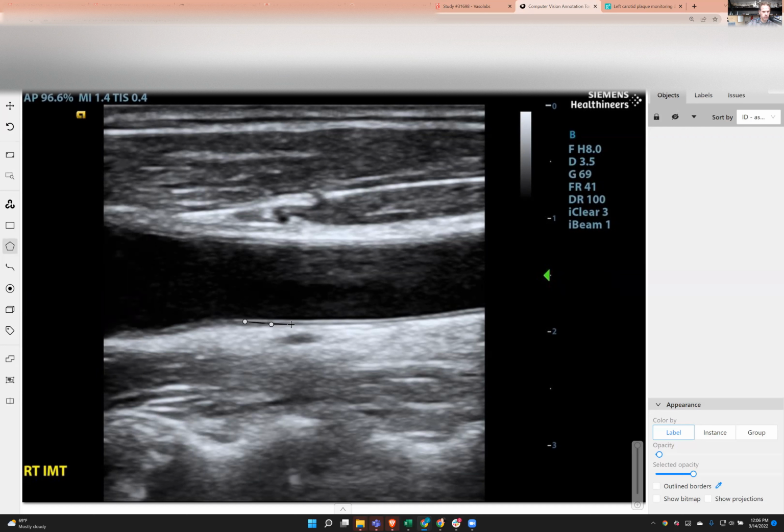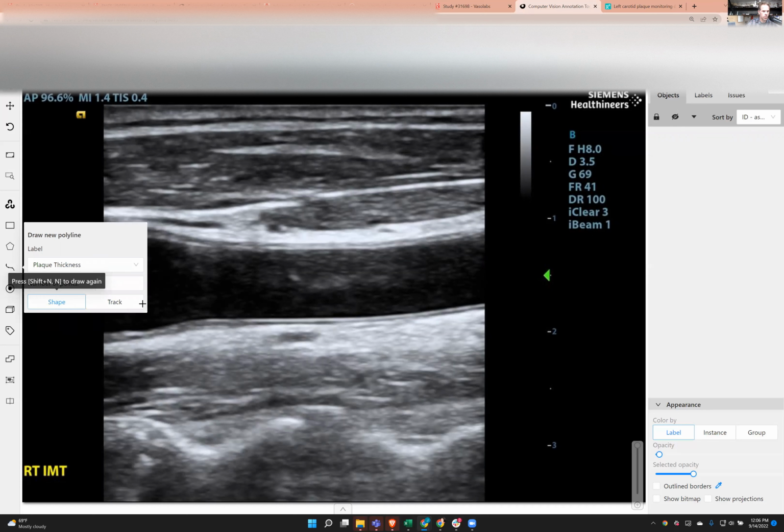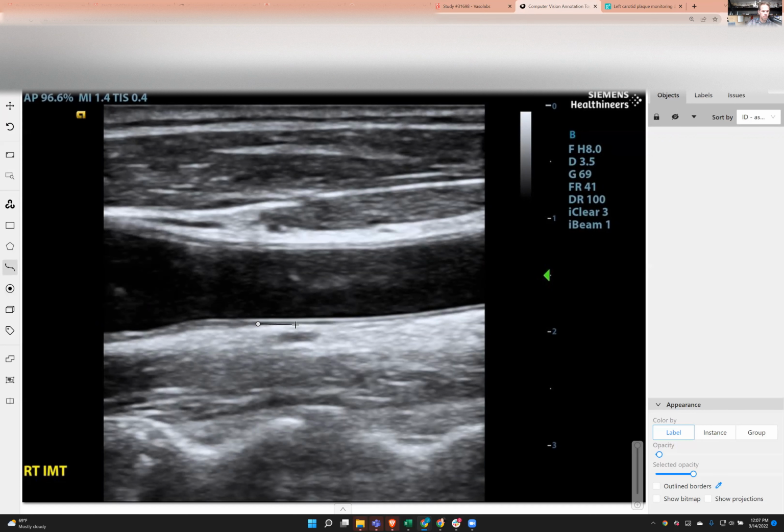So the IMT, the thing I'm measuring right now, is a measure of inflammation. Anything that's chronically assaulting your arteries will cause them to get thicker, this particular layer, to increase in thickness, and your body has to pump hard. Your heart has to work harder to push blood through all these inflexible arteries.